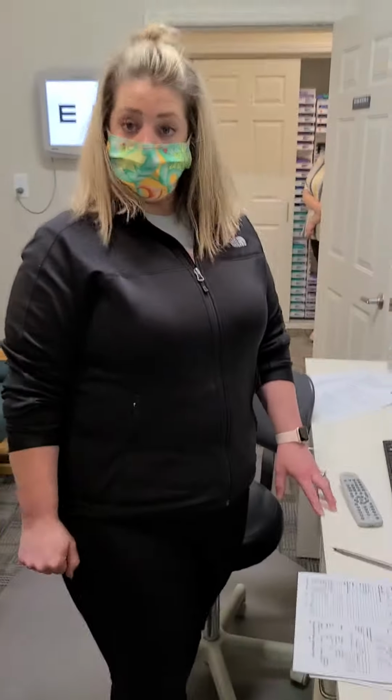So this you also want to do with a pinhole. Before you start checking count fingers, you want to try to pinhole them and see if they can see the E with the pinhole first. If they can't, that's when you go to see if they can count fingers.